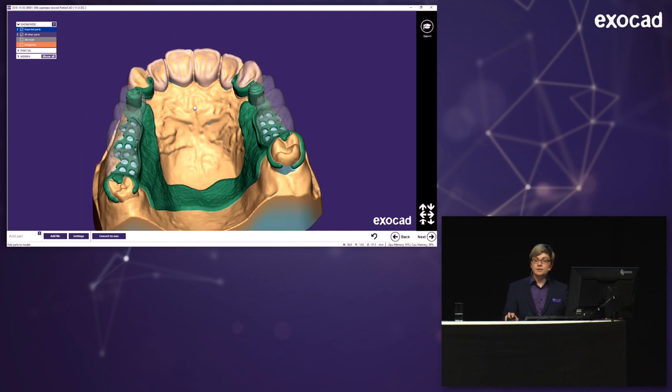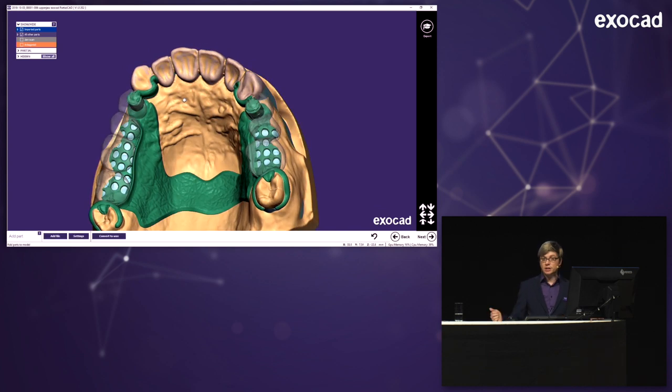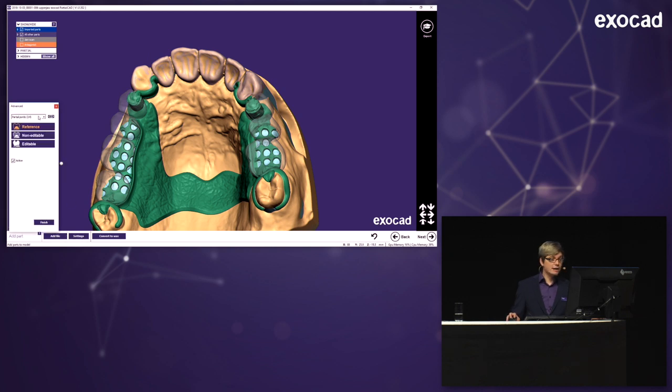And now there's a step that's called the add part step, where I can actually add all the constructions from before to my design. Normally, if you design a bridge, a crown, like the bridge we designed here, it will get added to your partial framework because it may be a secondary crown. So here in the settings, you can choose for every part what's actually happening with it. We have here all the pontics, which are the dummies for the acrylic teeth. We have here a bridge. The bridge, if you click on it, is non-editable. This means it will be imported, but you can't really work on the bridge. I will just use it as a reference.